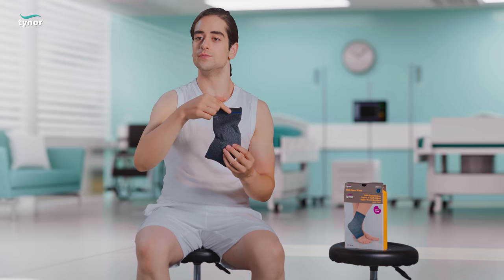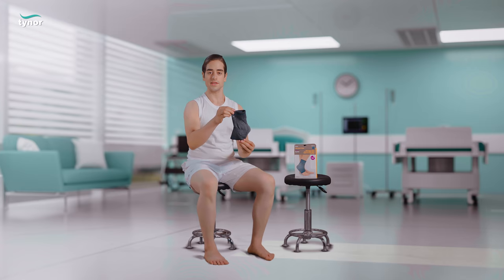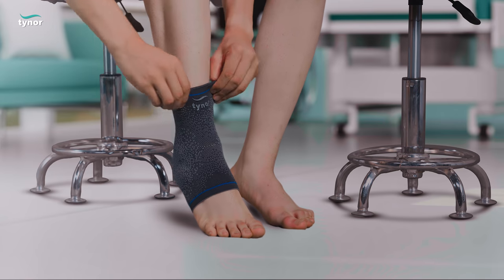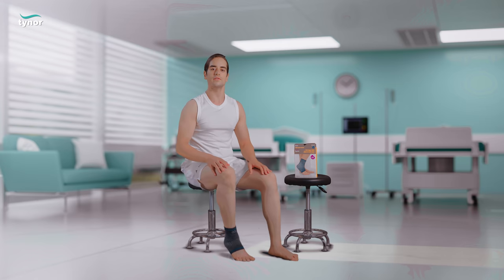Let me now show you how to wear the ankle support urban. The longer and broader portion should be facing upwards and the product can be worn simply as socks with a pull-on action. Line the silicone inserts near the malleolus on either side for a perfect fit.